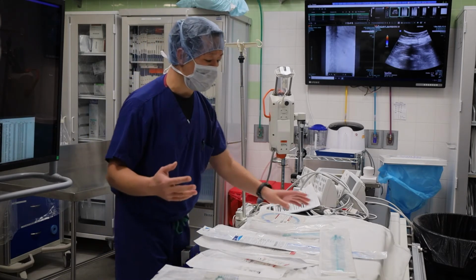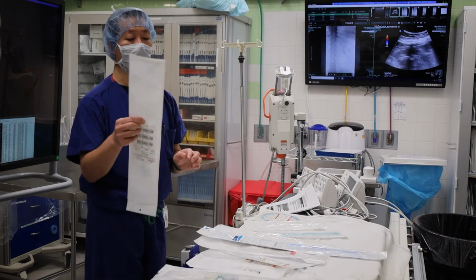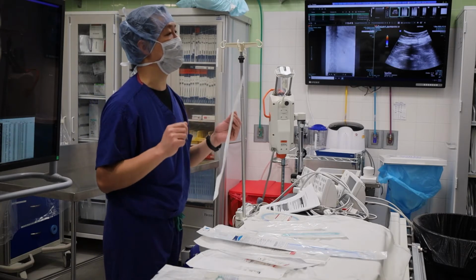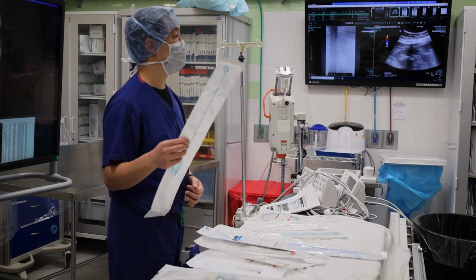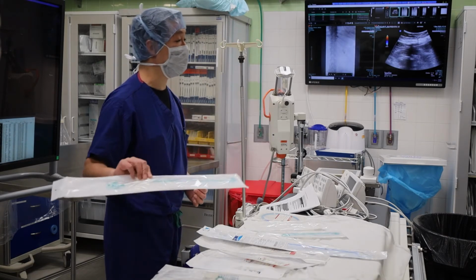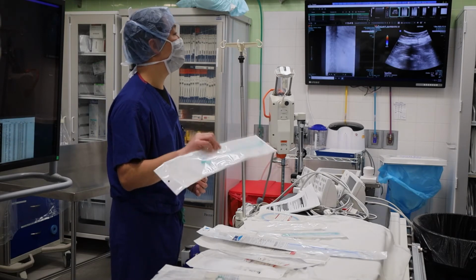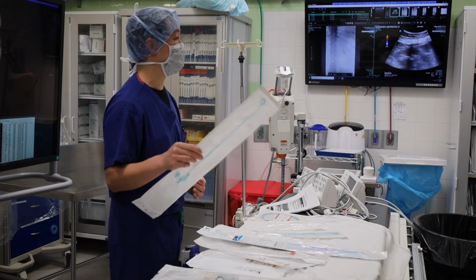When somebody has a perc Neph in, when they come back for routine exchanges, the part that's bad about 8 French is that they're just small. They tend to get kinked. They tend to get clogged. We oftentimes upsize to a 10. Because of trauma, and because when you get out at some point in the future, you don't want to have a leaking hole, we oftentimes don't go above 10. It's rare to go above 10.